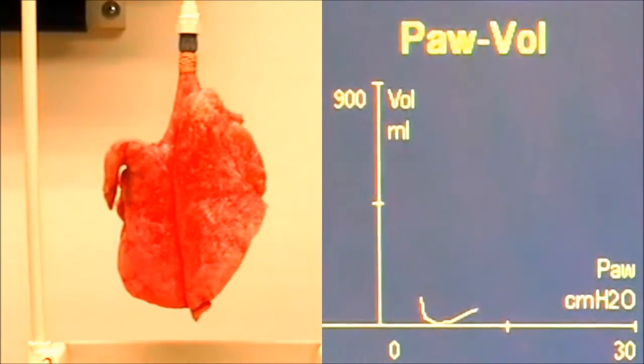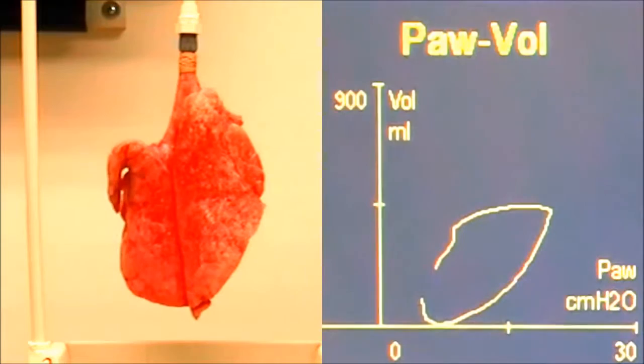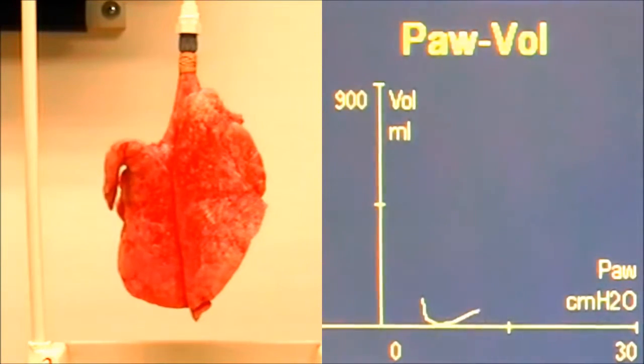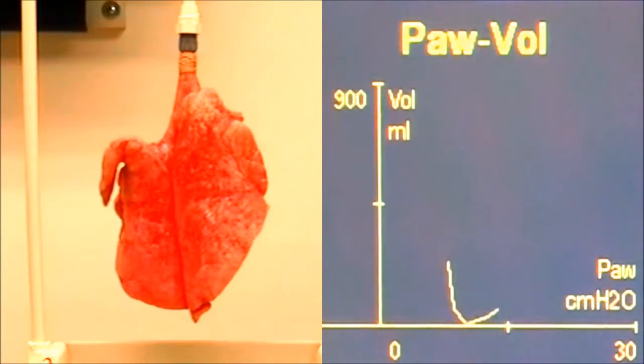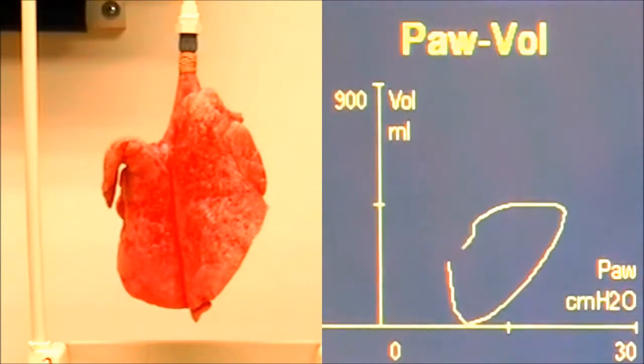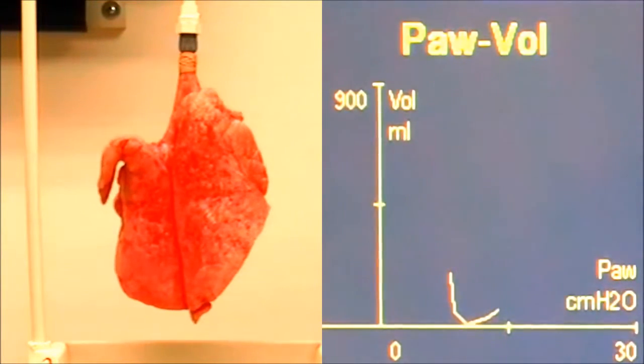The first thing I'm going to do is turn my PEEP up to 8. I'm going to switch over to my bag. Then turn my APL valve just slightly above 30 to around the 40 range. 30 to 40 is where you're targeting with your sustained recruitment breath.